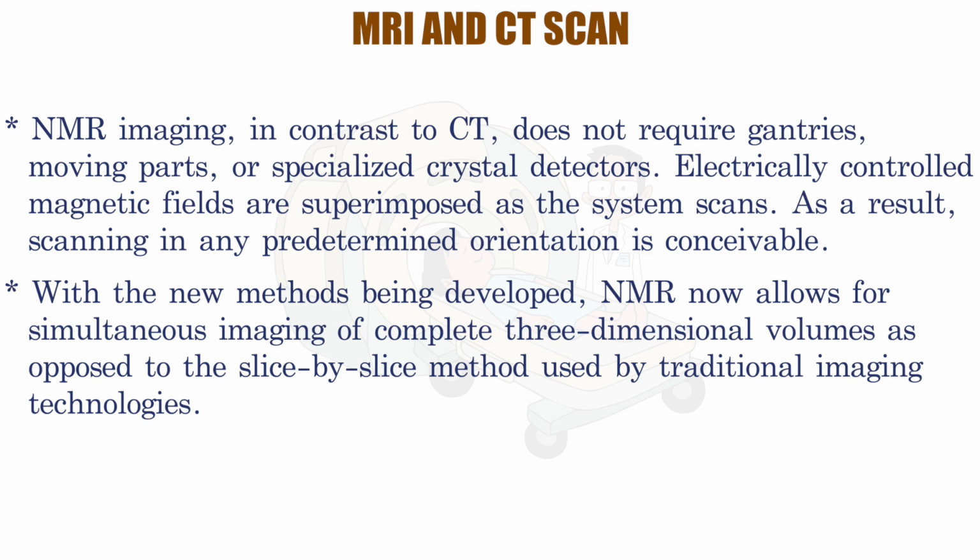Electrically controlled magnetic fields are superimposed as the system scans. As a result, scanning in any predetermined orientation is conceivable. With the new methods being developed, NMR now allows for simultaneous imaging of complete three-dimensional volumes as opposed to the slice by slice method used by traditional imaging technologies.